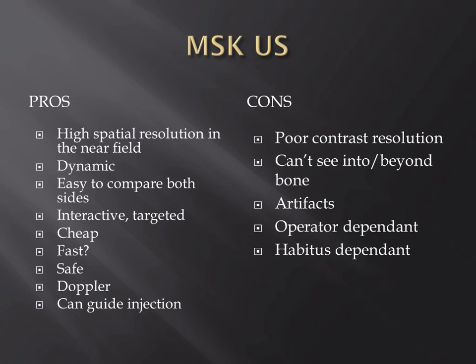Now, through this course, hopefully you've been able to develop in your mind kind of pros and cons of ultrasound in musculoskeletal evaluation. I'm not going to go through all of these, but this is a list that Tudor Hughes from UCSD put out, and under his pros he has FAST. Now, for many of us, as we're learning, FAST is not necessarily an advantage to musculoskeletal ultrasound, but if you've got a great technologist, someone that knows what they're doing, and if you're pretty facile and hands-on, it certainly could be the case.